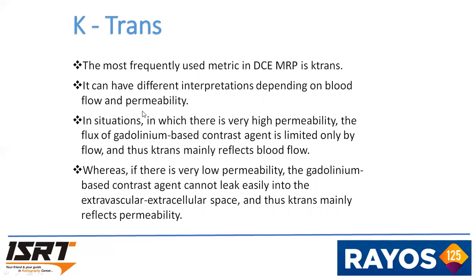Ktrans, the transfer constant, is the most frequently used metric in perfusion. It can have different interpretations depending on the blood flow and the permeability. In situations in which there is very high permeability, the flux of gadolinium-based contrast agent is limited only by flow, and the Ktrans mainly reflects blood flow.